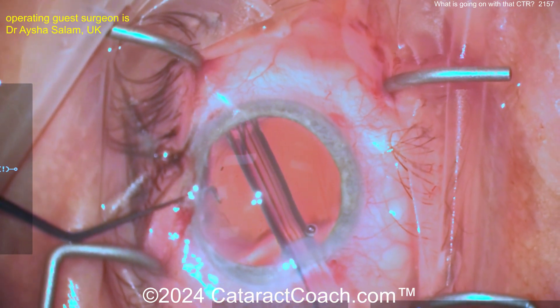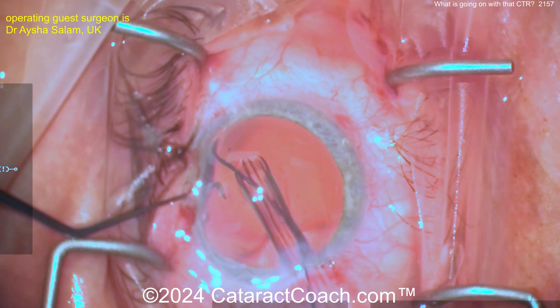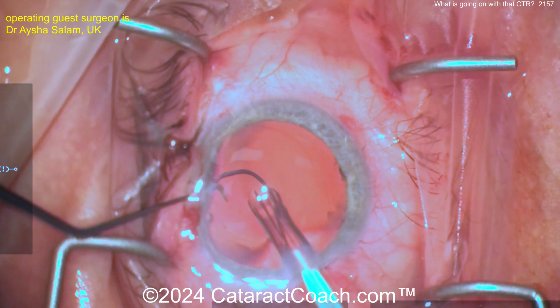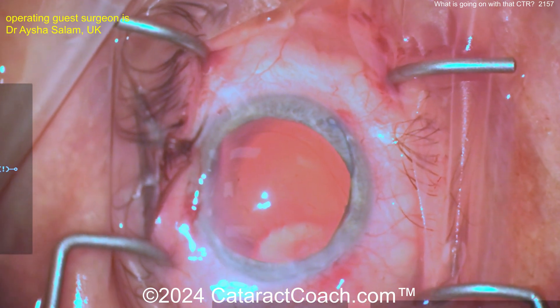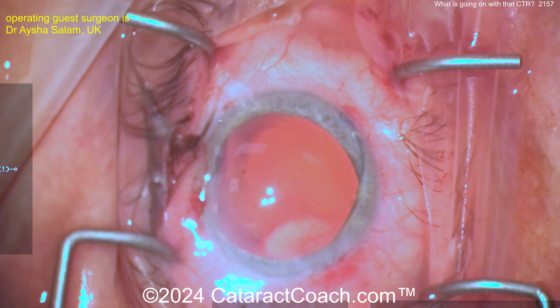You can hear the surgeon pushing it in and again the injector is too far into the eye, going too straight on — you need to be towards the sides. You want to come at a more tangential angle to inject the CTR. This looks all over the place. Finally it gets into the eye — luckily the capsular bag didn't break.